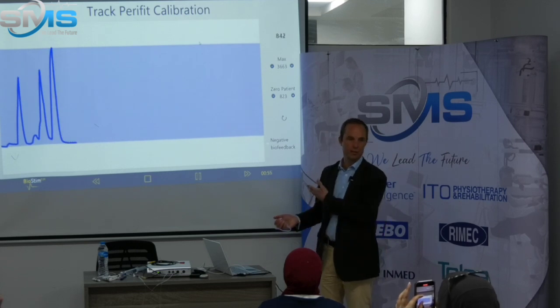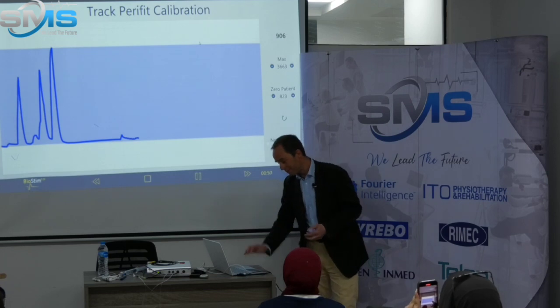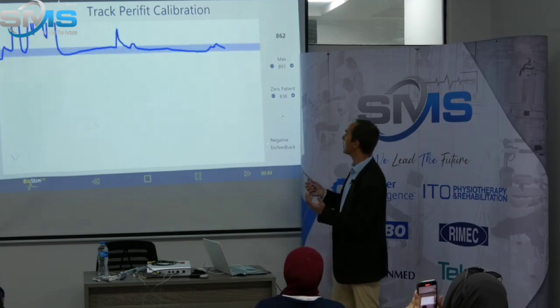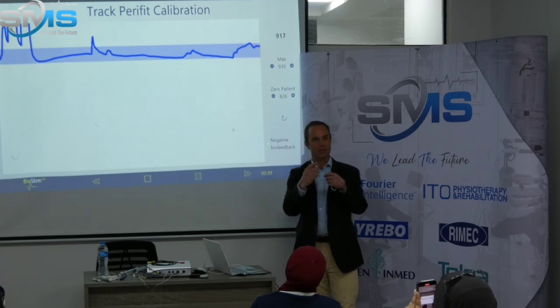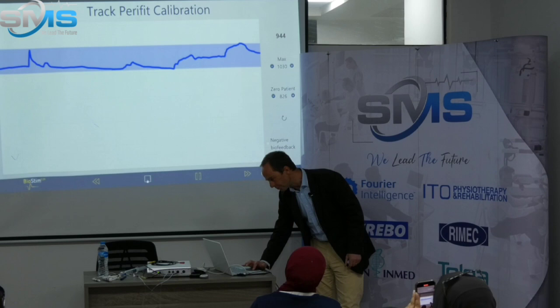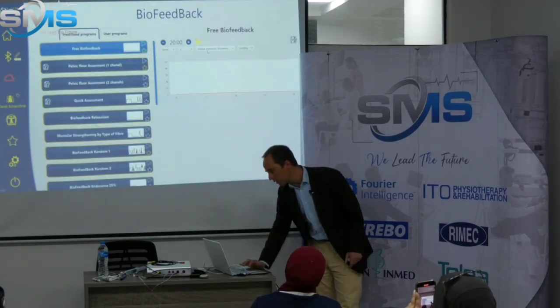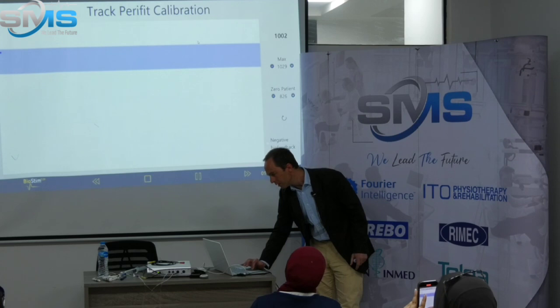If you're lucky, you see this. Very often you're not lucky because your patient, when you start, you'll see something like this. Okay, so that's nothing. You just see this line. So you have to find some ways to explain to your patient. So you can explain many different ways. Here, if with the curves she doesn't understand, you can try some other animation kind. So this one is often very used.